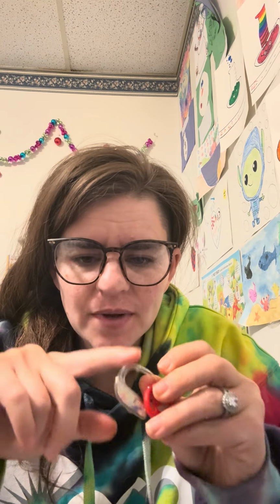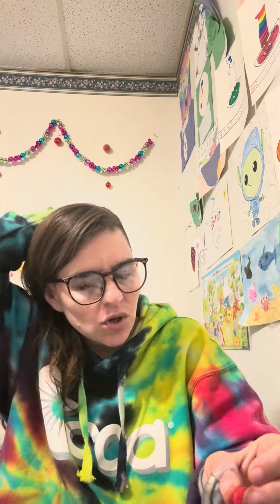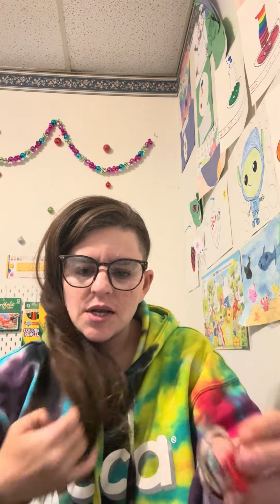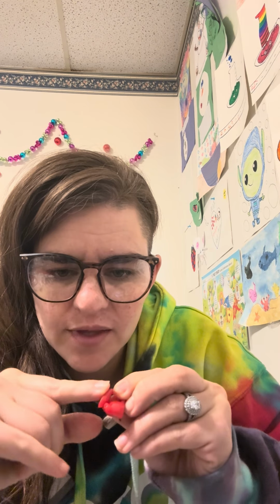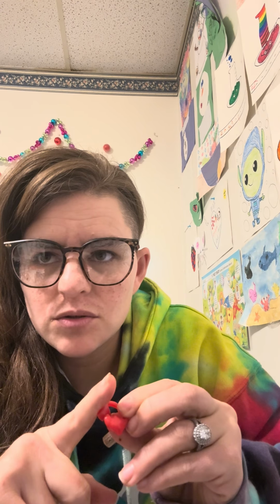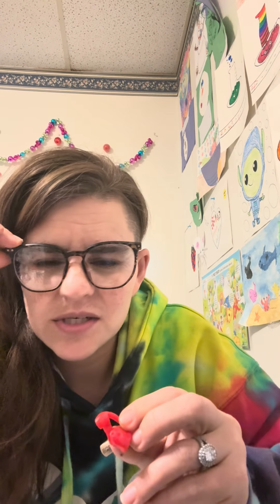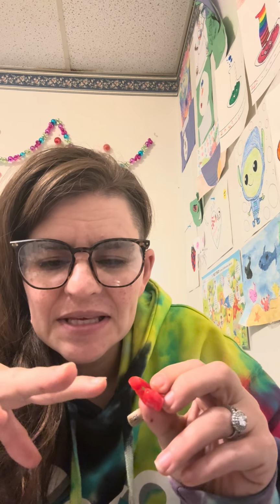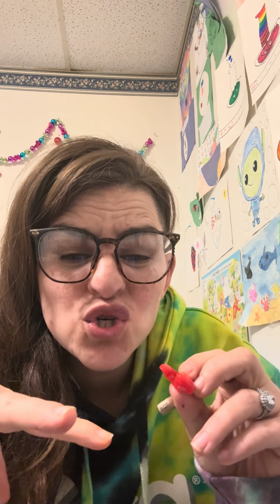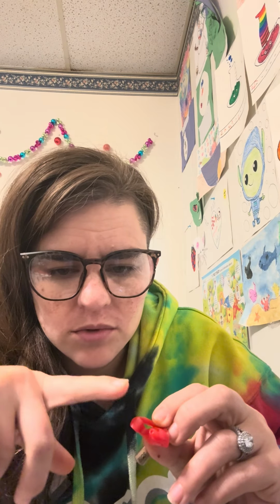Today I'm going to change my hearing aid tubing. Now, before you do any maintenance on your hearing aids, please consult with your audiologist. Now, I am going to clean the mold, which is silicone, and it's flexible. I'm going to wash it with soap and water, and I just use regular Dawn dish soap. And then you need to let it dry completely, like super bone dry, before you use it again.